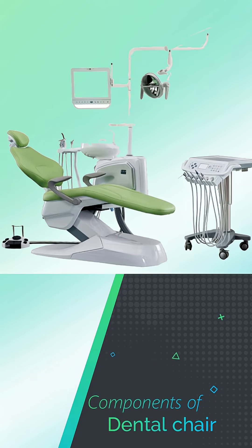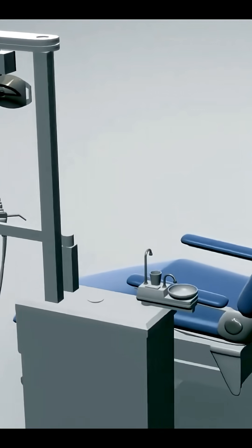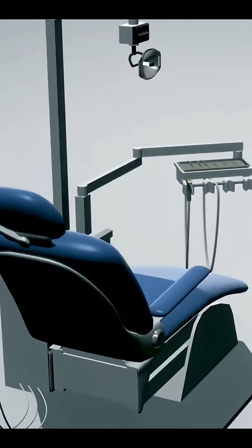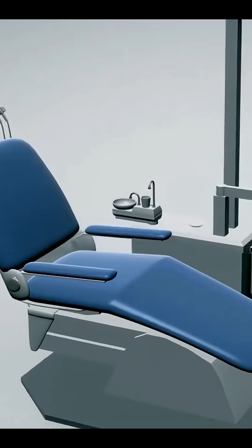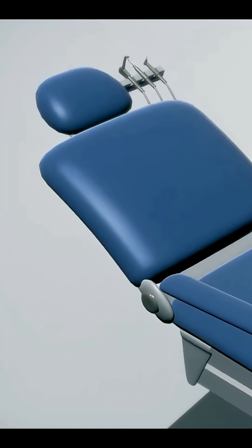Let's look into the components of dental chairs. There are several components of a dental chair that may seem overwhelming. However, these components are fashioned in such a way to deliver comfort, convenience, and functionality to the patient, the dentist, and the overall dental procedure.